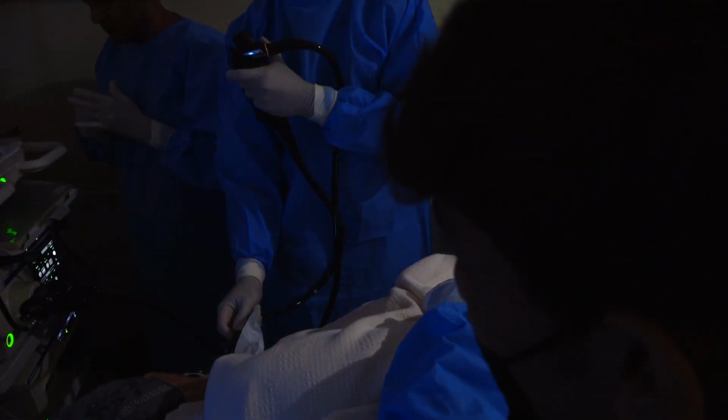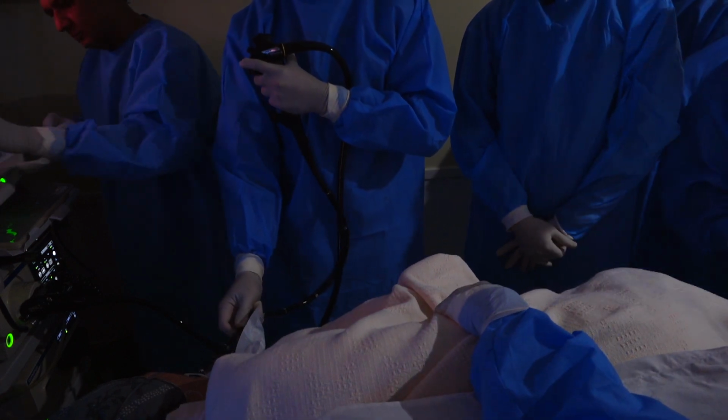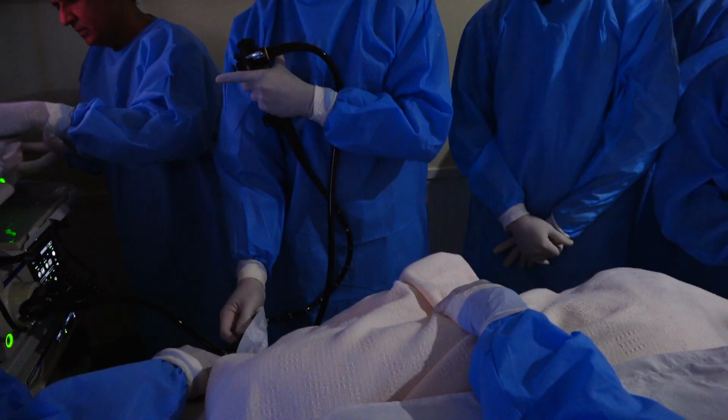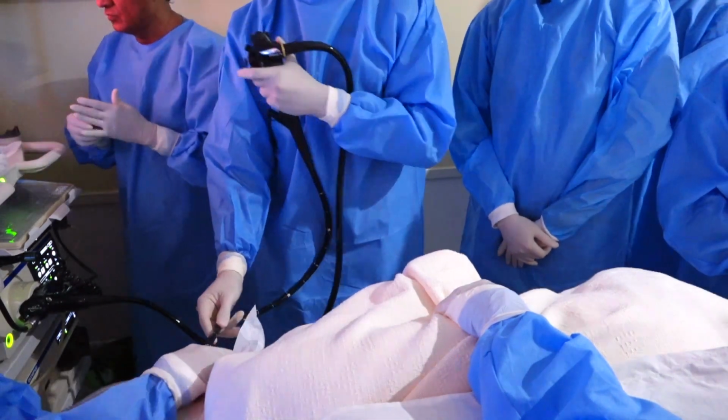Basically, she presented with a complaint of abdominal pain and constipation 1 month back in some private hospital. After doing initial baseline labs and CT scan, the CT was suggestive that there is a lesion in the gastric cardia, which is around 1.8 to 1.2 centimeter.